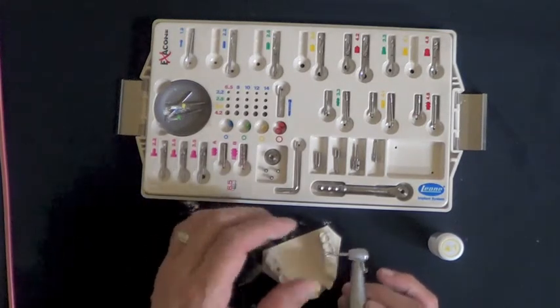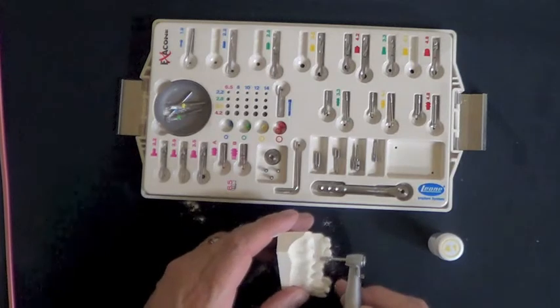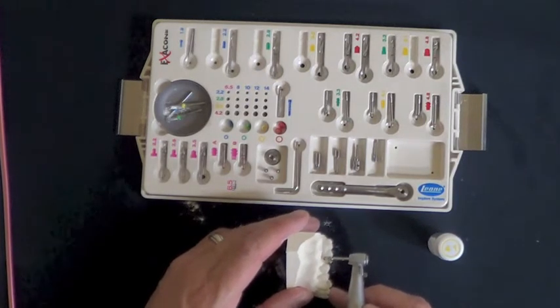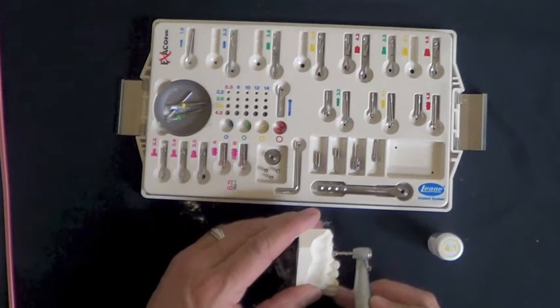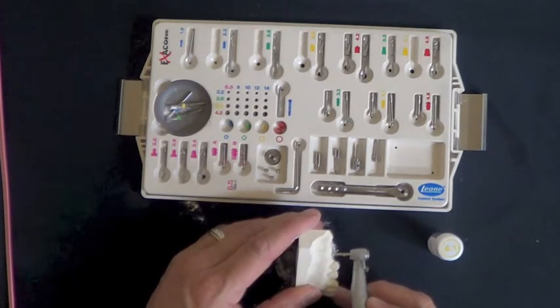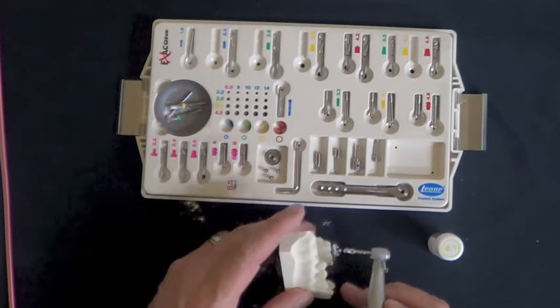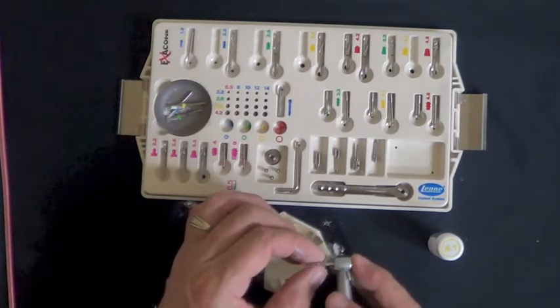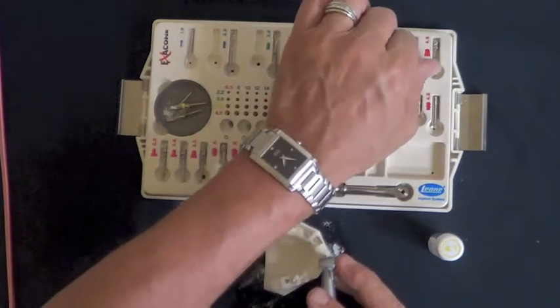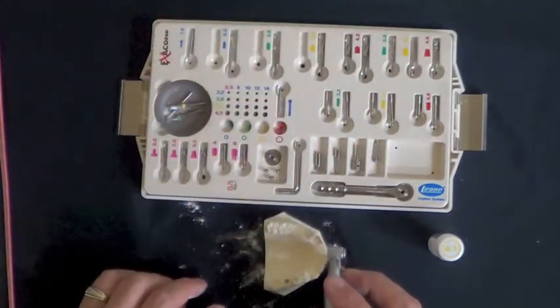Place it on the motor driven handpiece. Generally you would run this at about 300 RPMs, taking it down to the countersink line. The countersink just makes the top of the osteotomy slightly wider in the cortical bone area to give us what we need to place the implant.